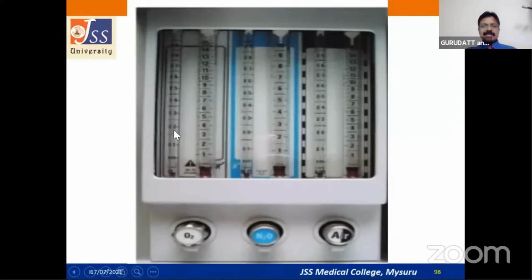That's why in the modern anesthesia workstations, you have 2 flow meters, arranged in series, for each of the gases. Now you can see here, oxygen 2 flow meters, nitrous oxide 2 flow meters, and air 2 flow meters are there. That means the first flow meter, which is for the low flows, you can give up to 1 liter here. So you can be very accurate as far as the low flow technique is concerned. This question will be asked: why there have to be 2 flow meters and how they are arranged. They are arranged in series. That means this 1 liter will continue into the high flow flow meter.